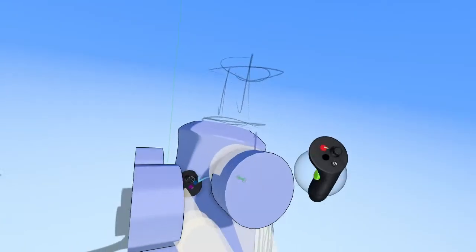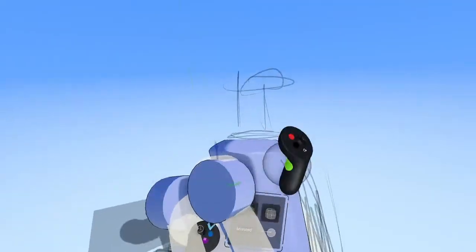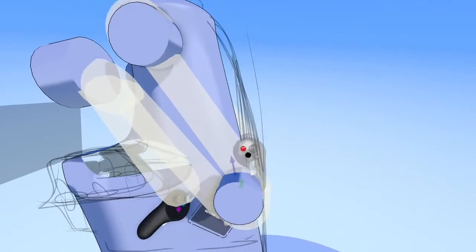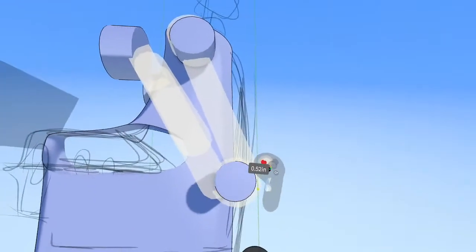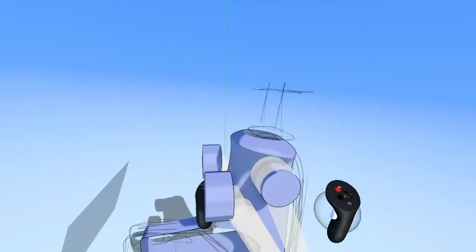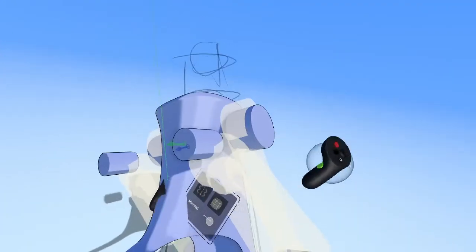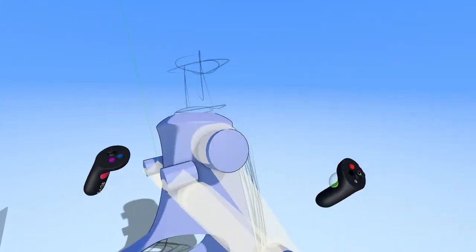And because we left it as a primitive shape, we can still adjust the general size of the shoulder like this with these 2 arrows. And use Smart Move to move it along an axis. All right, I think I want the elbow to be a little bit deeper, shoulder to be shallow like that, and then the wrist to be the smallest pivot point. And we'll shift that in a bit.